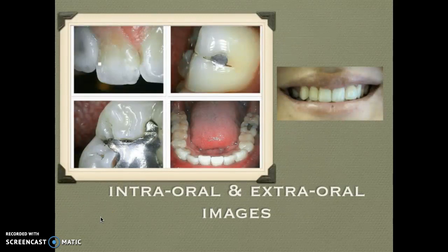And the advantage of using an intraoral camera is that it takes the image, such as one tooth, and magnifies it 500 times. So when the doctor is examining a patient's tooth and they say, you need a new filling in this upper right molar, usually patients just say, okay. With an intraoral camera, we can actually show the patient, you can see where the old amalgam is breaking down, or where there might be recurrent decay or fractures in the tooth.